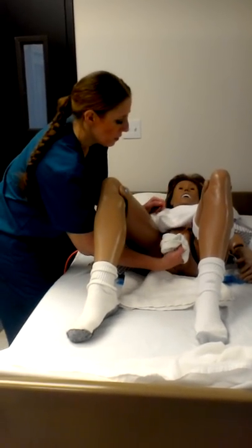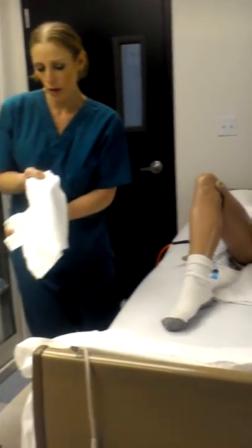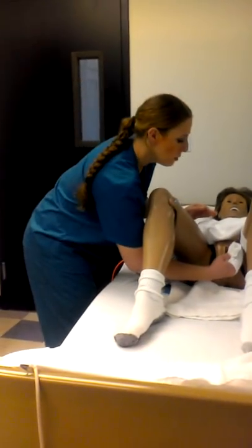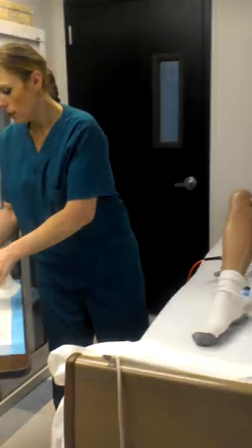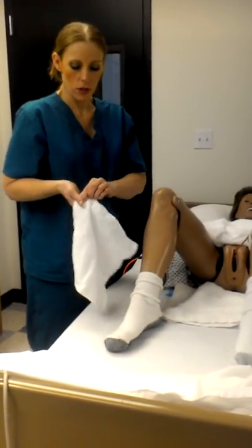Then you take your pinky finger and you go down the middle. Turn the washcloth around. Then you're going to wash the labias just like that. You can use this hand to pretend like you're holding open the lips, but then you're going to rinse the same way.